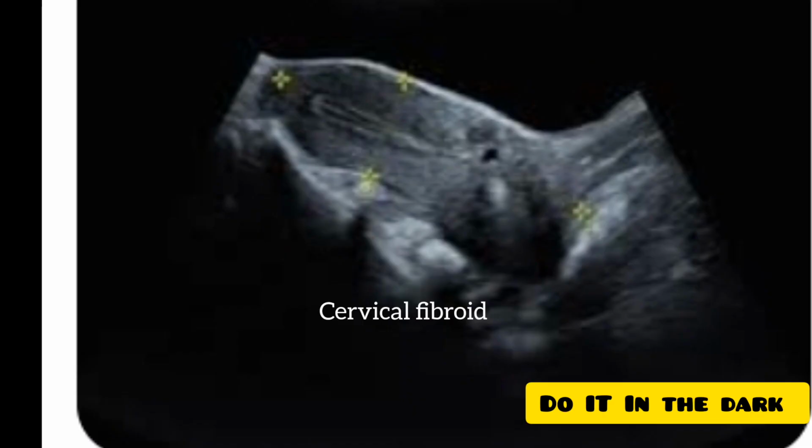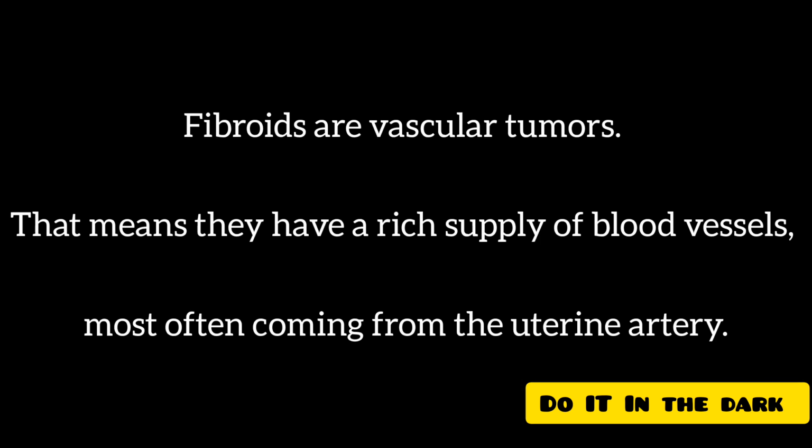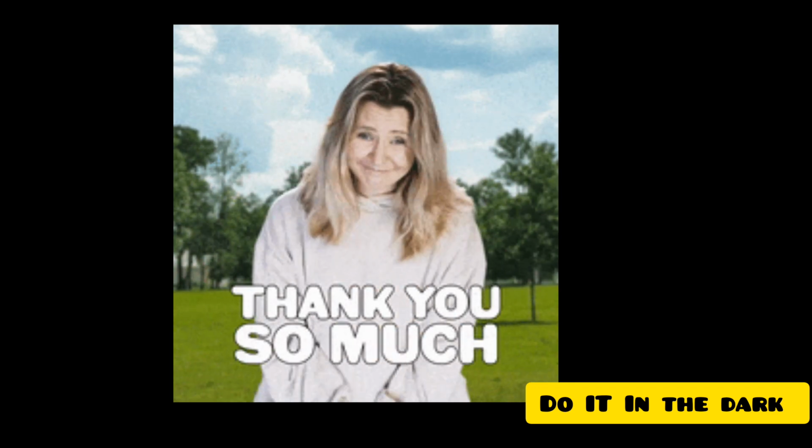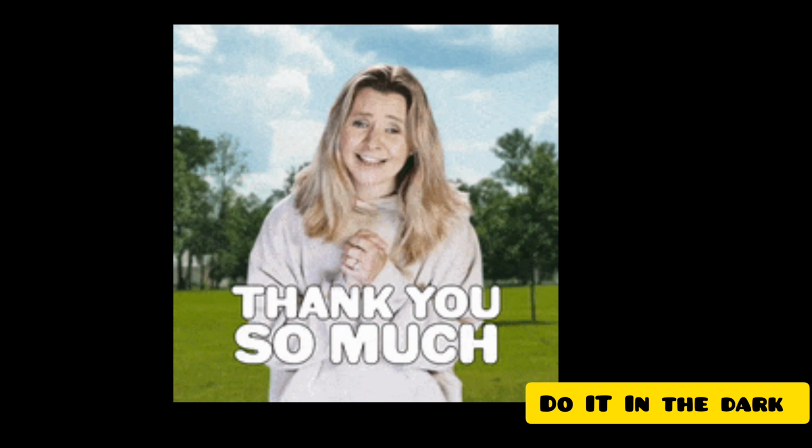And here you can see the cervical fibroid. Fibroid is present in the cervical region, and fibroids are vascular tumors. That means they have a rich supply of blood vessels, most often coming from the uterine artery. So we have discussed a few ultrasonographic appearances of different types of fibroids.